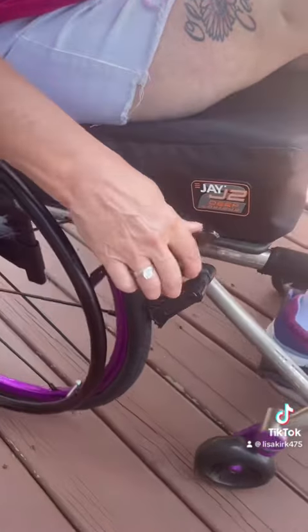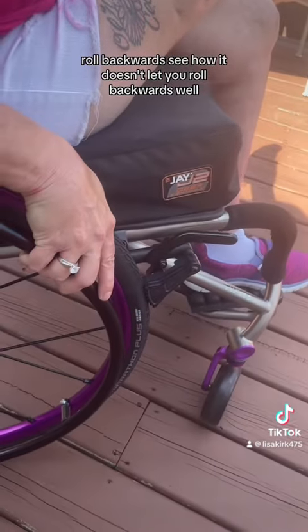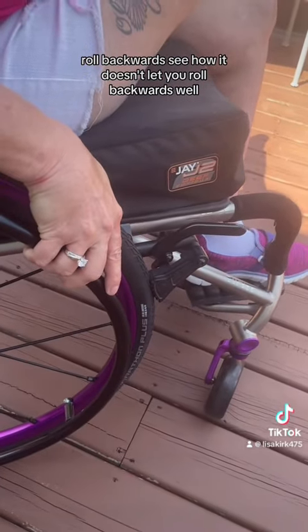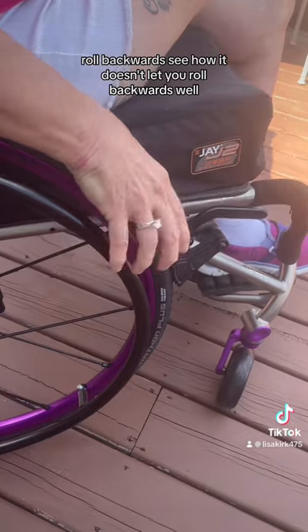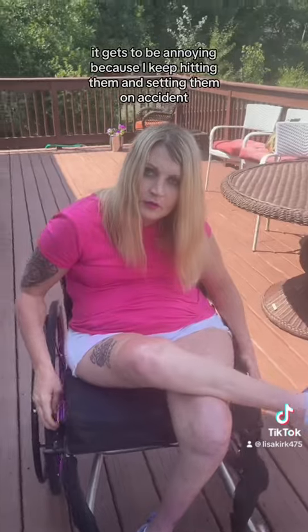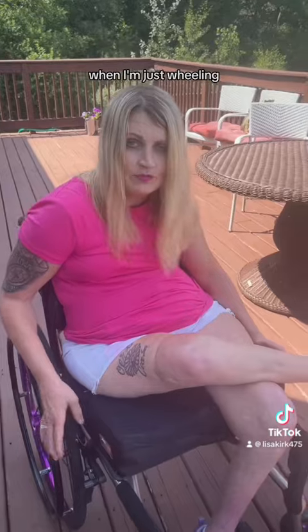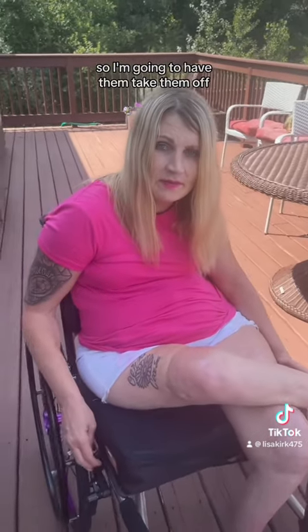When you set them, you roll backwards — see how it doesn't let you roll backwards? That's pretty helpful. However, it gets to be annoying because I keep hitting them and setting them on accident when I'm just wheeling. So I'm going to have them taken off, I think.